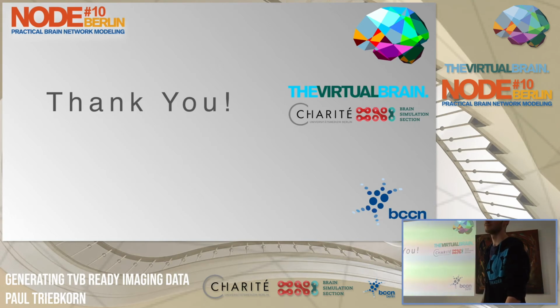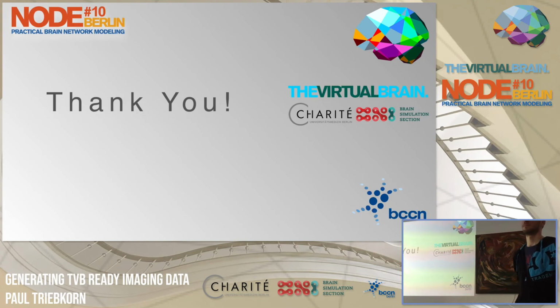I have done this for epilepsy like 30 times, right? And I still don't feel that I can look at an image and tell if something is wrong or not. So my question is, how easy is it for the non-expert user to use one of these pipelines without really having to put his hands on the images, correct an error, or find out an error? And if there are such errors that usually, I guess, come because of bad quality of images, could you identify the steps where more often one needs to put some more expert input there?